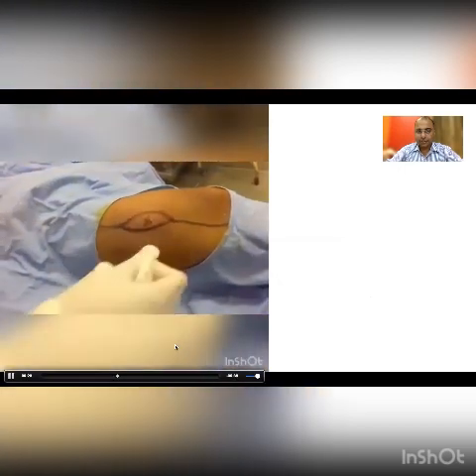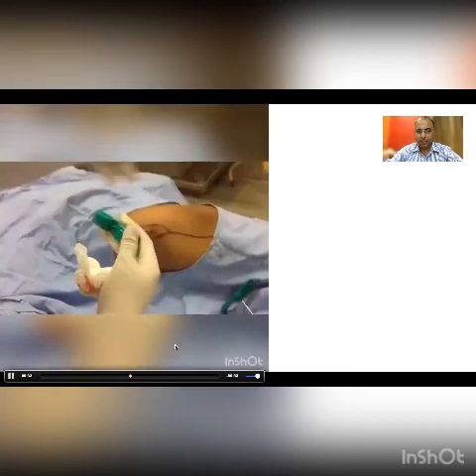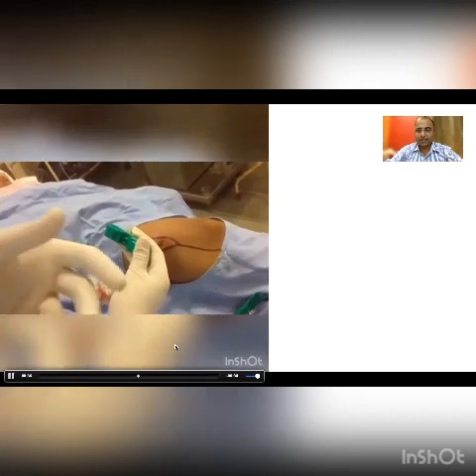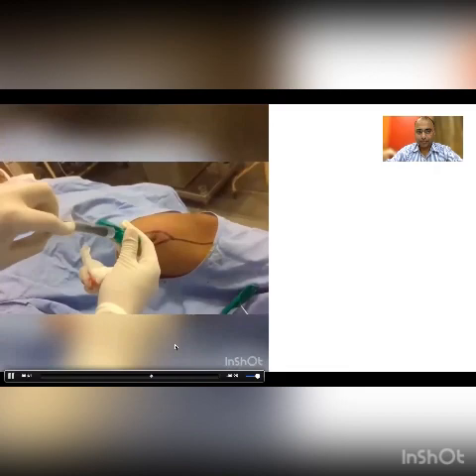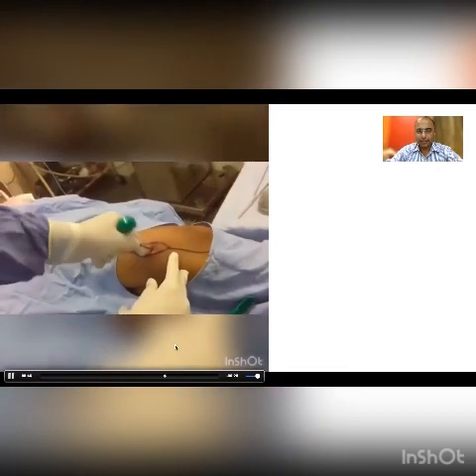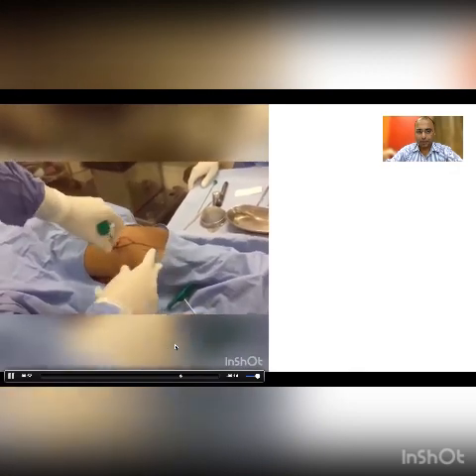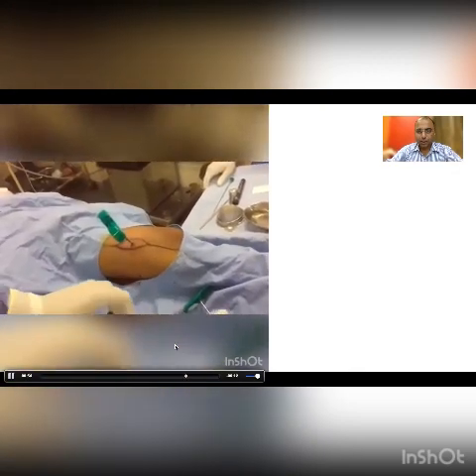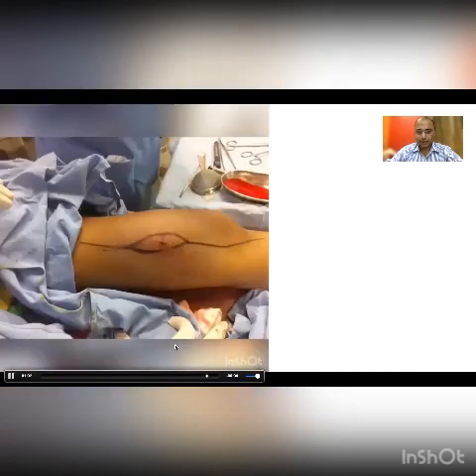The surgeon takes the Jamshidi needle in hand and performs a screwing and rotating movement, attempting to aspirate any material coming out from the needle. Around three to four good cores are taken. The surgeon inserts the needle again into the affected bone to obtain three to four good cores, which are sent to the pathologist. A single suture is taken to close.